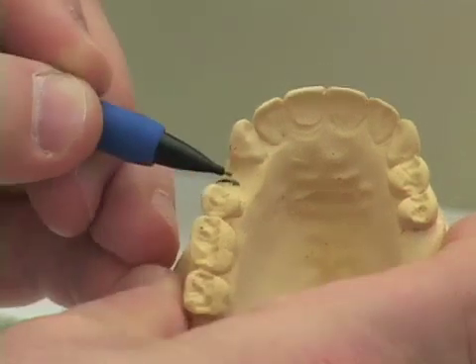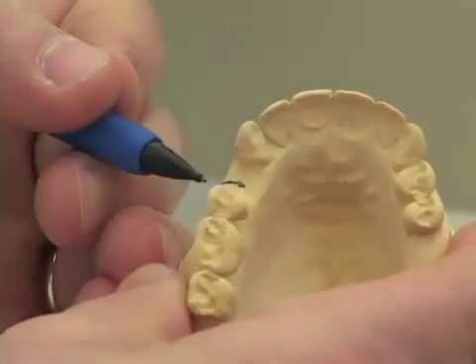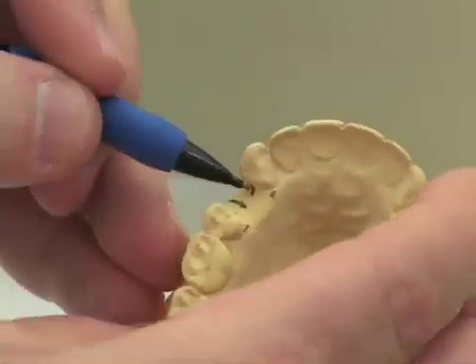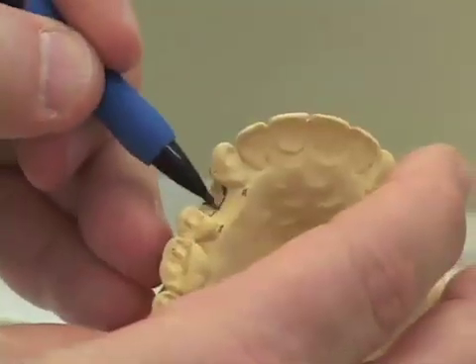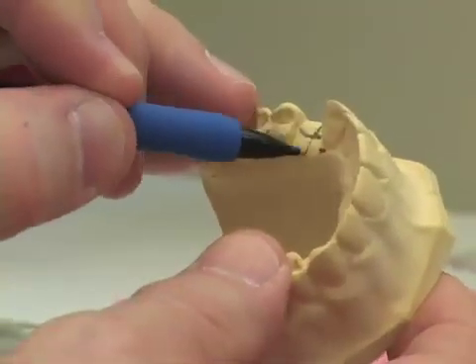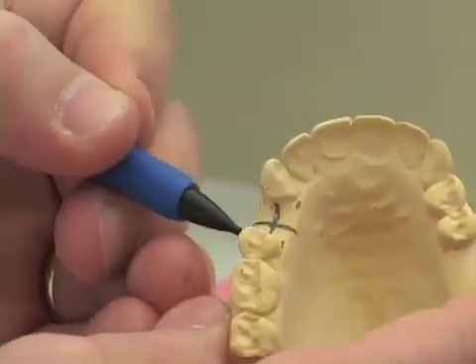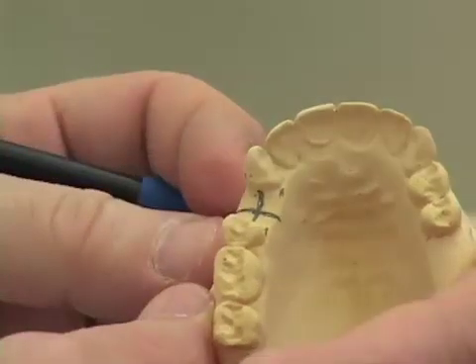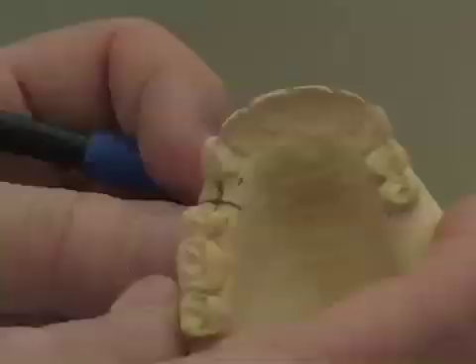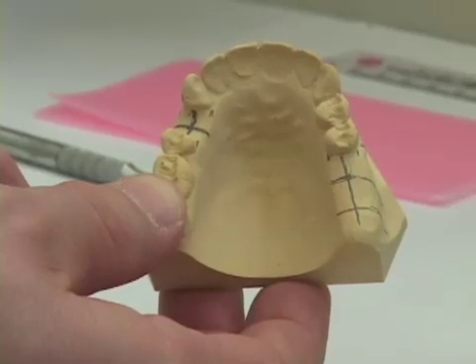I do not want to locate the implant too far toward the buccal, which would leave insufficient bone covering the buccal aspect of the implant. I connect these two areas from center of tooth to center of tooth, making sure that the cross isn't too close to the buccal surface of the cast. This marks our proposed location for the implant in the single-tooth area.